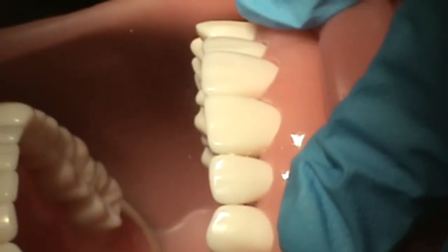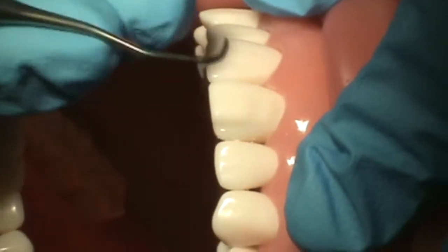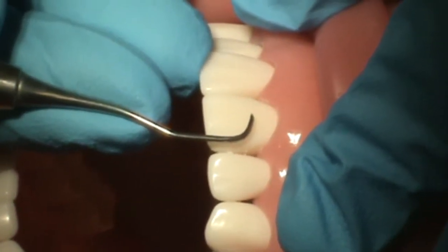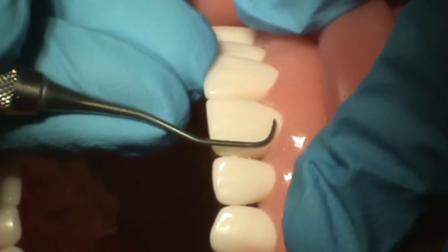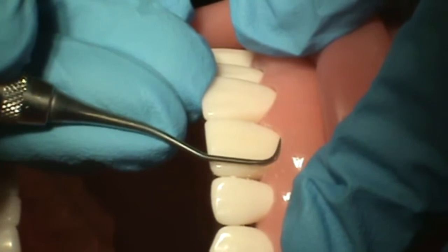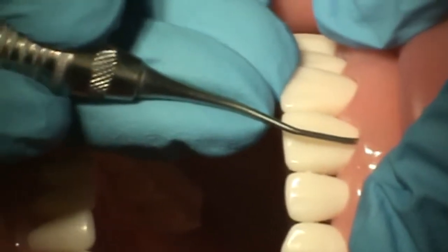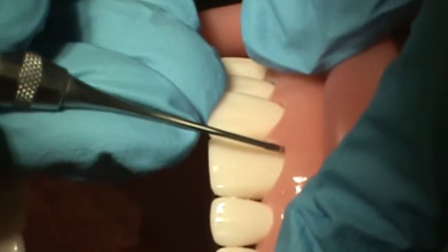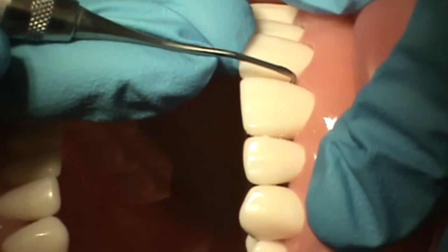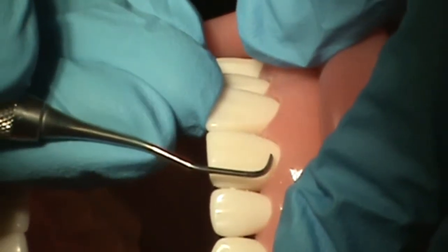So we are going to establish the correct edge. She is holding her instrument in a modified pen grasp and has a secure fulcrum. She will gently slide the instrument under the gums at the midline of number 9, hugging the root of the tooth at a 0 degree angulation. As long as the cutting edge is in contact with the root, the clinician does not have to worry about angulation, as Gracey curettes are self-angled at 70 degrees. This allows for effective removal of deposits without tissue trauma.